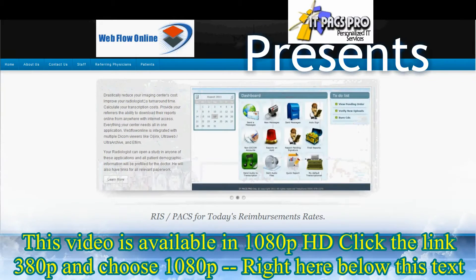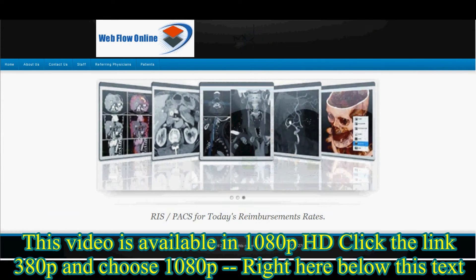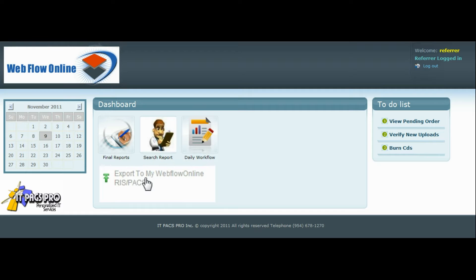Thank you for joining us. ITPACS Pro presents Webflow Online. This video demonstrates how a Webflow Online product being used by a radiologist can be easily implemented into a Webflow Online RISPax being used by an imaging center.